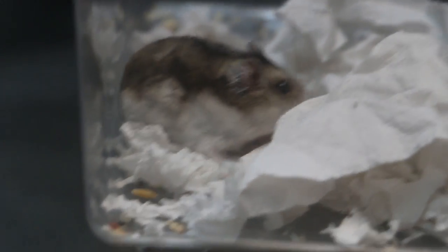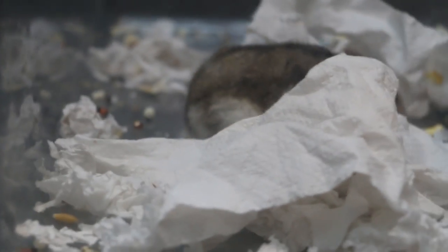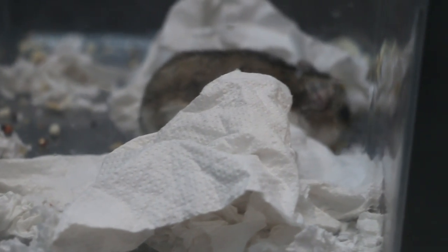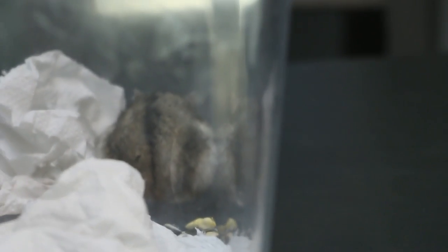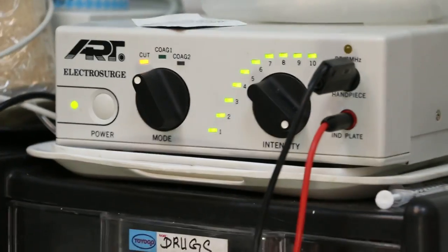A dwarf hamster with a leg wart has been sedated. July 7, 2015, and we're waiting for her to doze off. Sedation was Zoletil 100 IM. Surgery to remove the wart will be using electro-surgical.